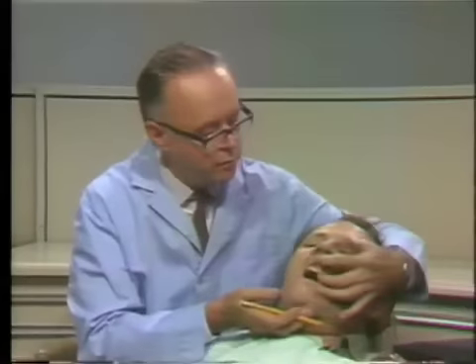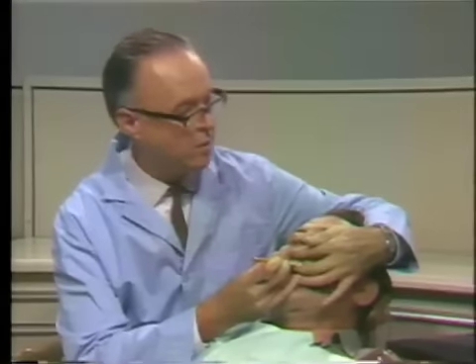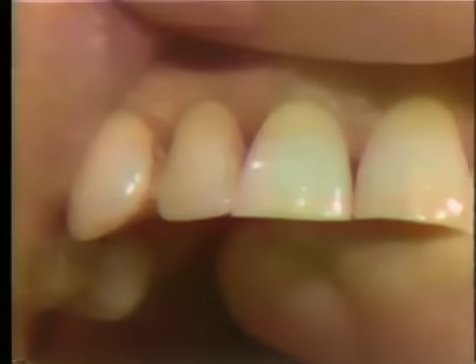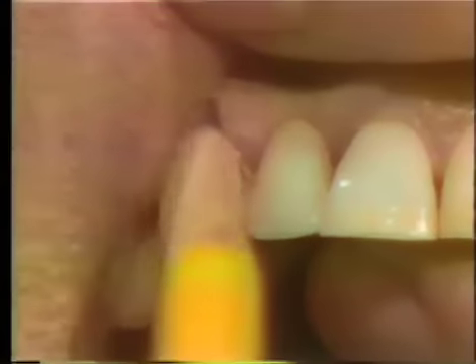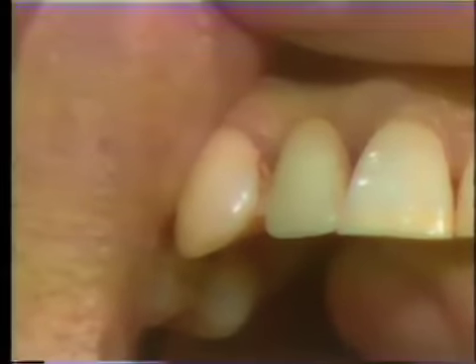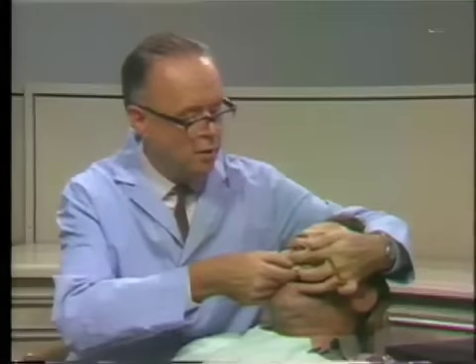And then we do the same thing on the proximal surface of the cuspid tooth. And if you just turn your head this way, we can do that. In this particular situation here with an imbricated tooth, I think you can see in here that the position of the gold margin there is quite critical. For example, if you were thinking of doing a 3/4 crown on this tooth, you would find yourself having to come way onto the proximal surface here in order to get the proximal retention groove. And in this situation, the pin ledge has considerable advantages. That's the first line drawn on the proximal of the cuspid tooth there.